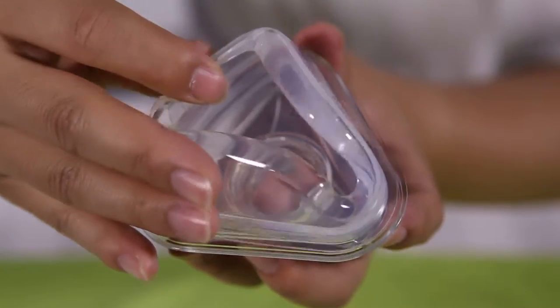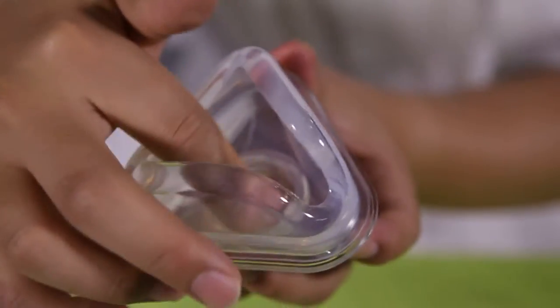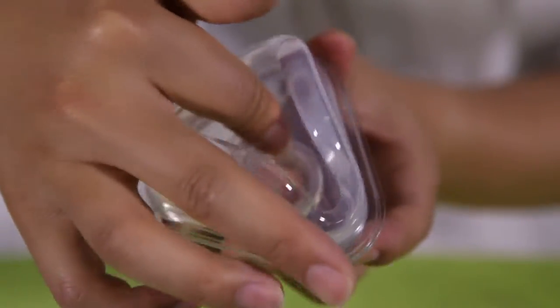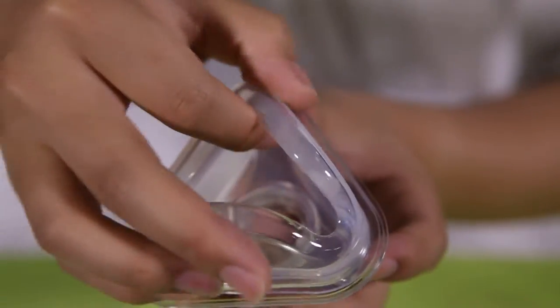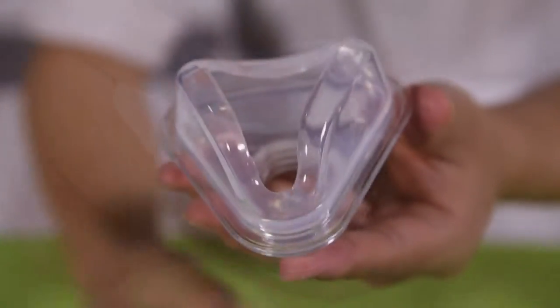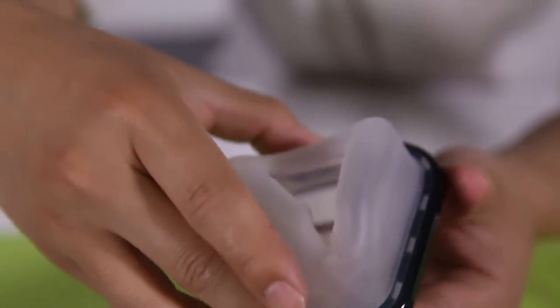Lock the inner cushion securely into the cushion support frame. Ensure that the cushion bulge fits snugly inside the groove of the cushion frame. Assemble the inner cushion pad without the level pad.